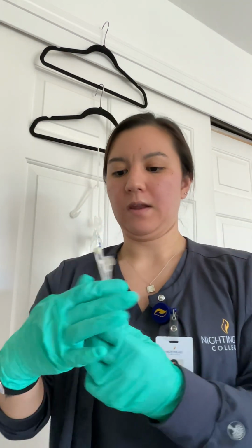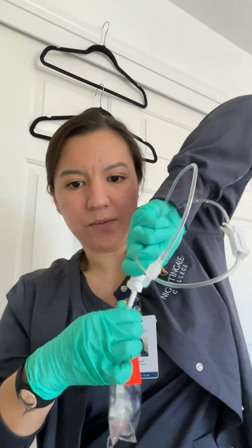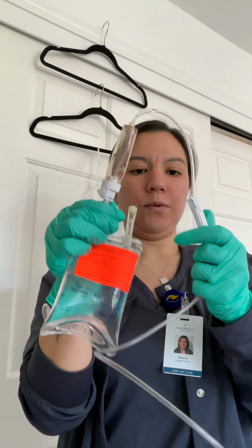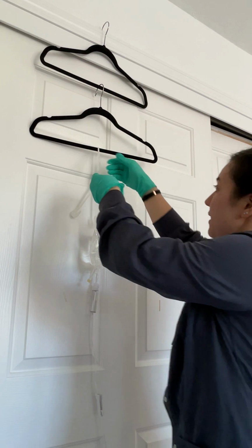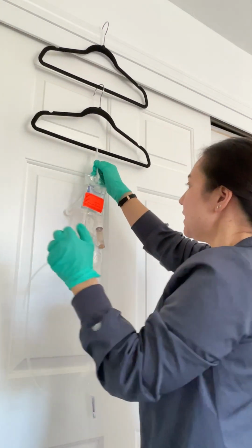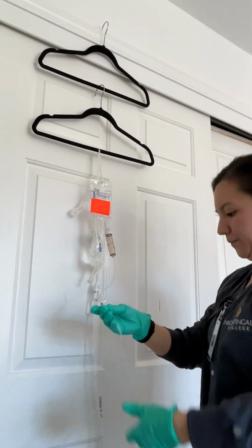All right. I'm going to grab my tubing, take off the spike cover, and we're going to spike this one, pushing it all the way through. Alrighty. Same thing with this one. We're just going to make sure that the roll clamp is all the way down before flipping it. This piggyback is going to hang higher than our actual fluid. So same thing with this one. We're going to squeeze the tube, making sure that we get it halfway full.